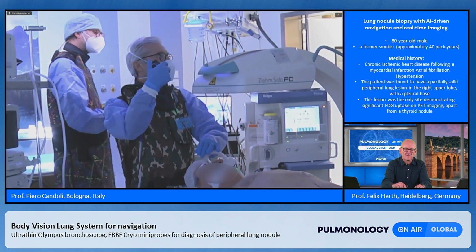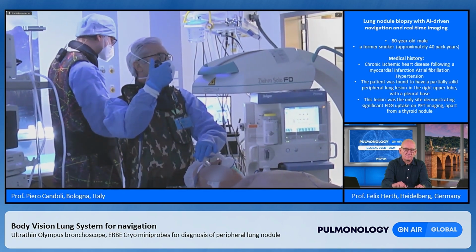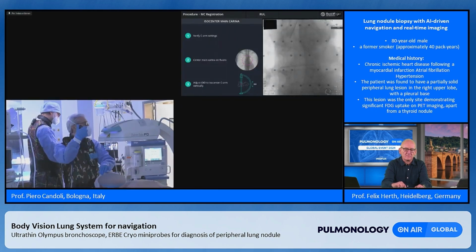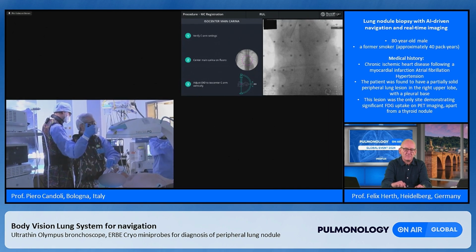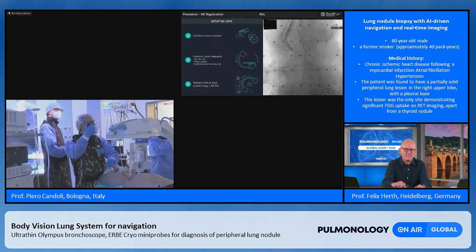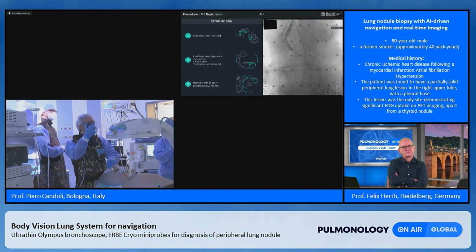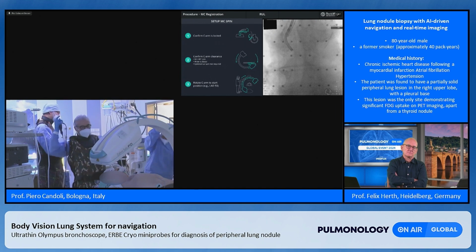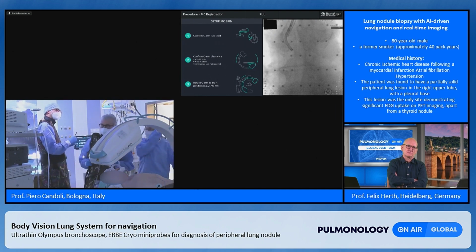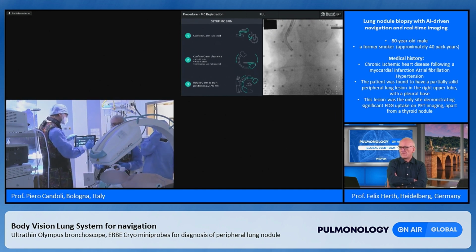We have already put the fluoroscopy C-arm on the patient. We need to center the fluoroscopy beam on the main carina, and for this the tip of the scope will help us. With the tip of the scope we go on the main carina, and after we are sure that the carina is centered, we can make the registration, performing a first spin.